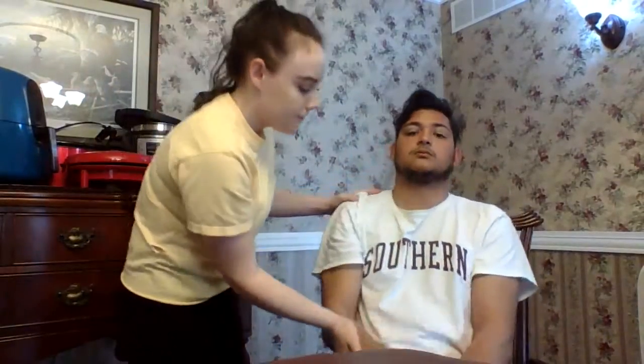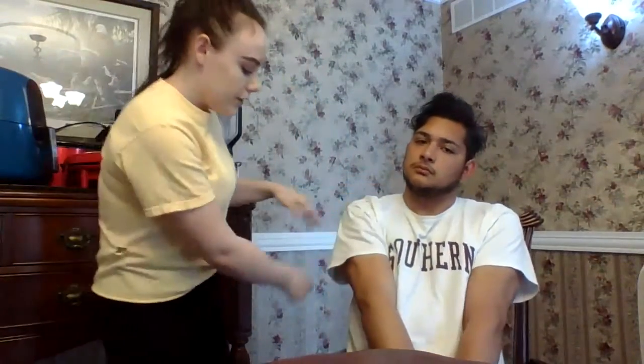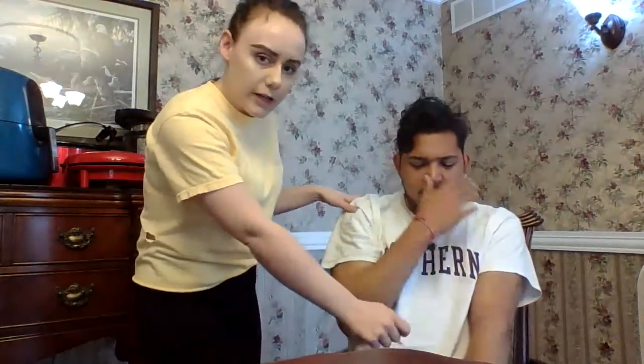I'm going to make sure my patient is back and comfortable in bed. I'm going to make sure his 2 side rails are up, his bed is low and locked, and that he has his call light in reach. So now that I've done all that, I'm going to foam one more time when I exit the patient's room. I'm going to come back to my nurse's station and document. So I'm going to draw a line through the time it was administered. I'm going to write my initials, and I'm going to document that I injected it into the right forearm.